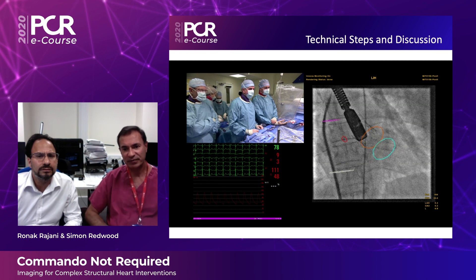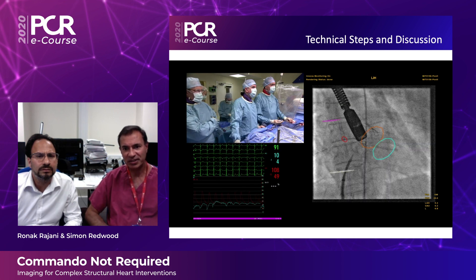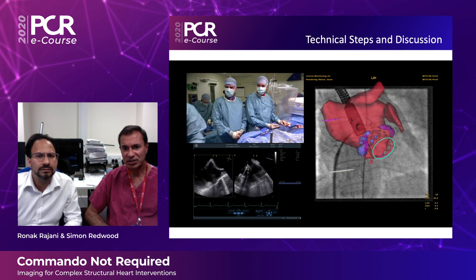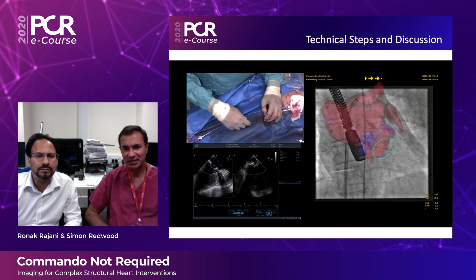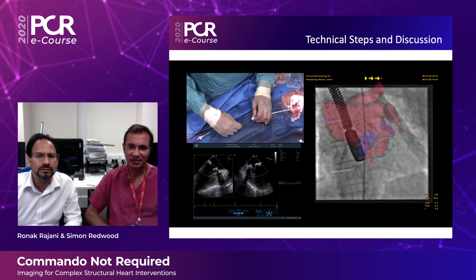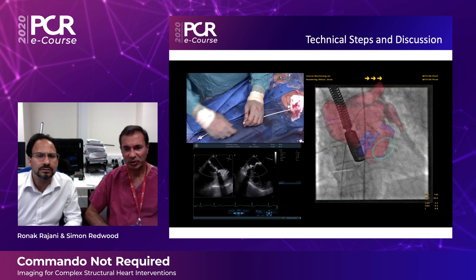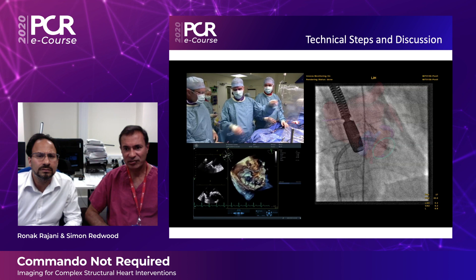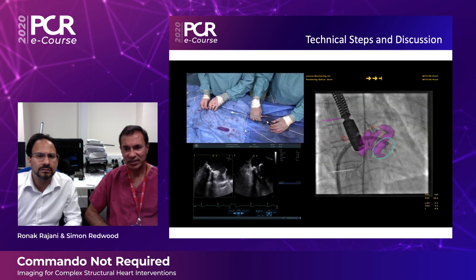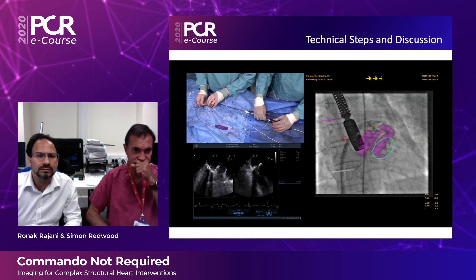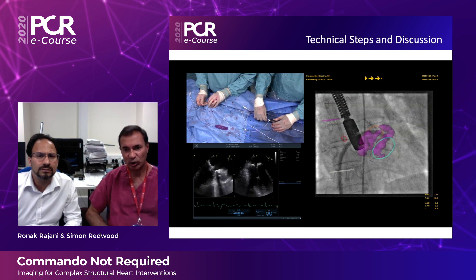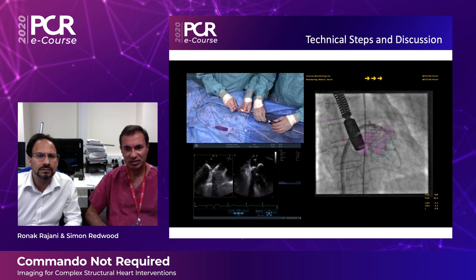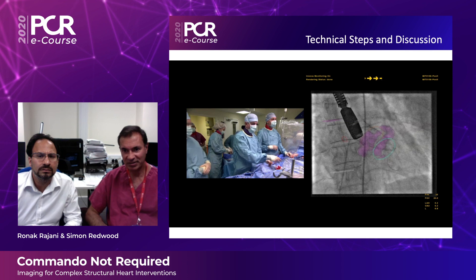Here we are just about to perform the transeptal puncture, and I'm exchanging the transeptal kit in order to bring an Agilis catheter into the left atrium. We pointed the Agilis down through the mitral valve, introduced a pigtail into the left ventricle, and then exchanged that for a safari wire. On the distal end of the safari wire I put an extra bend to mimic that bend going around into the left ventricle.